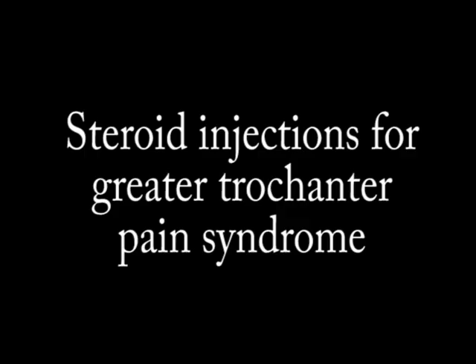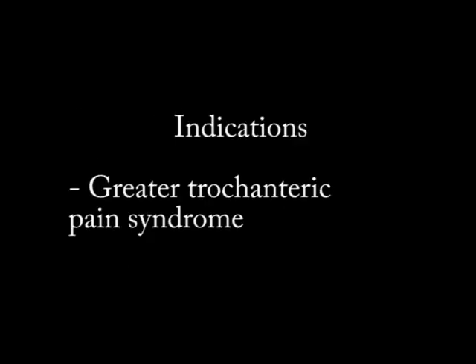So what do I use them for? As the title suggests, we're using them for greater trochanteric pain syndrome. So individuals who are complaining of lateral hip pain focused over the GT that's not responding to conservative treatment. So that would be the indication.